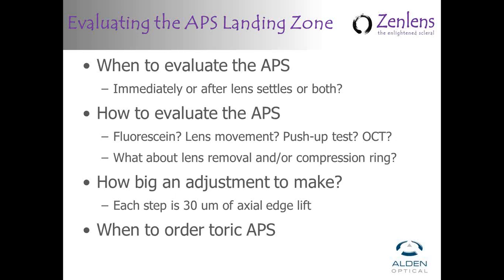We shouldn't see fluorescein rushing under the contact. That means the lens is just too flat and the edges are too flat and it's going to create problems. I'd actually rather see little or no fluorescein exchange just with blinking. But then what I would like to do is use the patient's lower and upper lids to gently nudge some fluorescein under the edge of the contact.